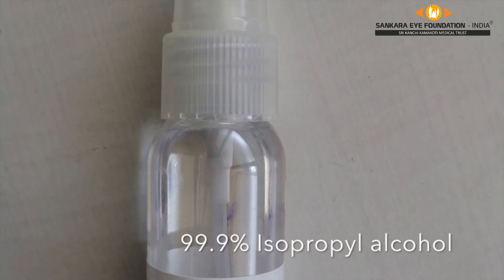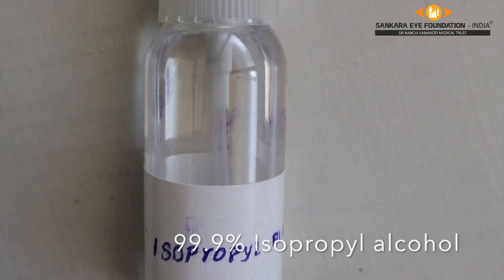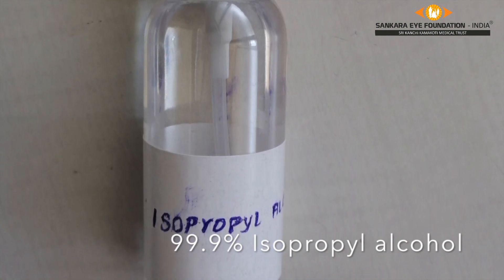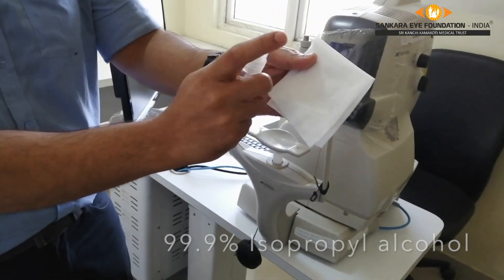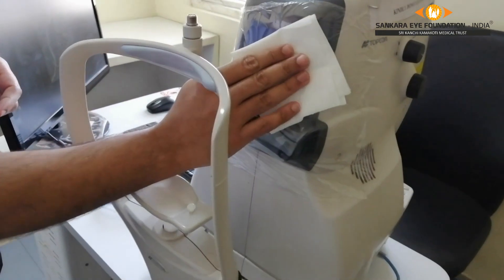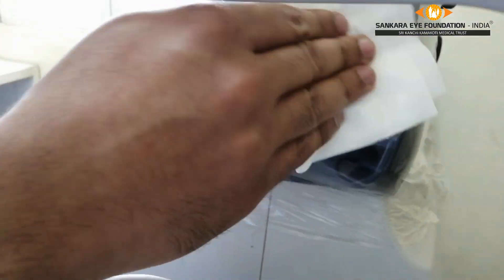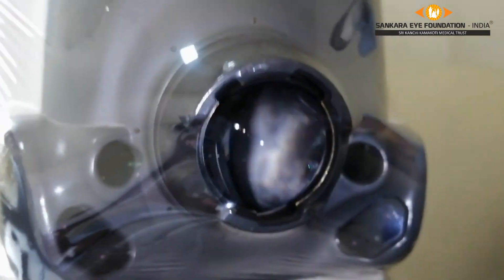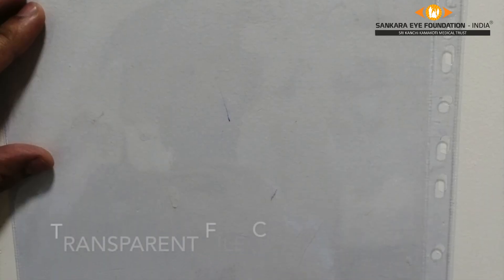Isopropyl alcohol can be used for cleaning. Put the isopropyl alcohol in a spray bottle, then apply 2 sprays onto a clean tissue paper and gently clean the front cover all over, especially in the area covering the lens. We can see the cover is absolutely clear with no contaminants and there is no lens fogging.